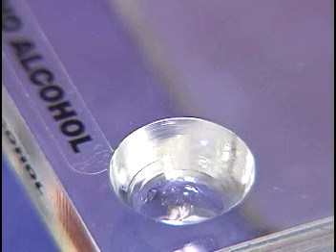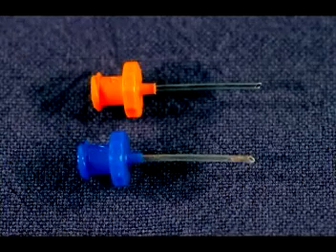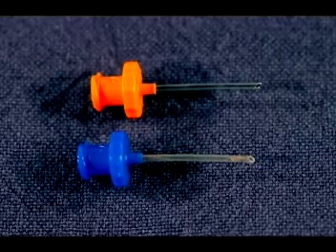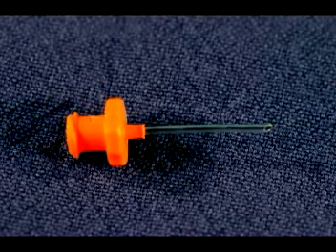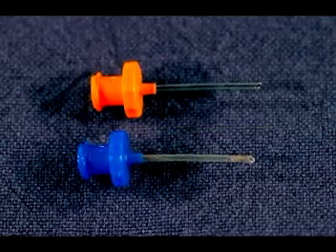However, a place is reserved for it in the intubation kit together with the stock number and the 800 number of Webster Veterinary Supply. Two sizes of endotracheal tubes are supplied. The larger tube, with a blue connector, is 1.27 millimeters in diameter and is suitable for mice weighing more than 21 to 22 grams. The smaller tube, color-coded orange, is 1.22 millimeters in diameter and can be used for mice weighing as little as 17 to 18 grams. Unlike the rat, mouse endotracheal tubes are not tied in place. Attempting to tie the tube in usually results in accidental extubation, and the tubes fit tightly enough that with care, ties are not required.